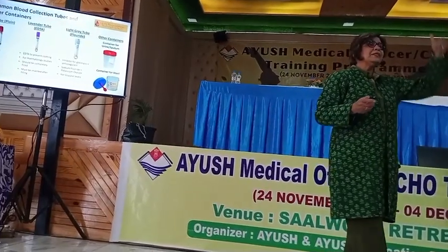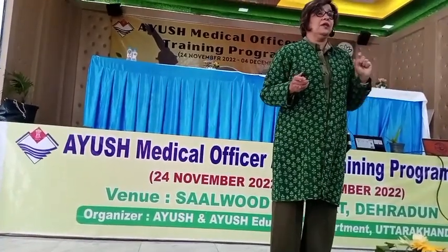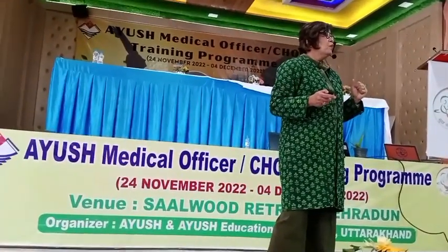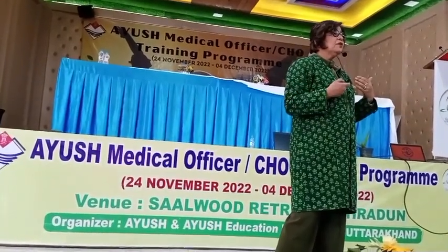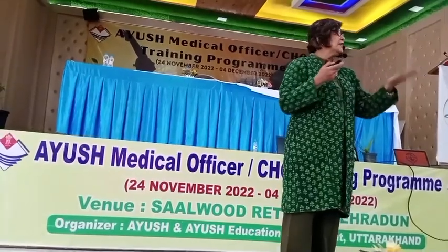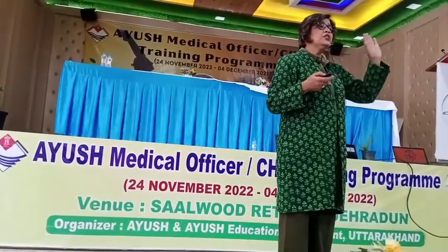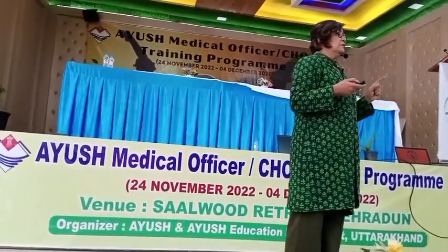Now what happens is sometimes the patient comes and says my hemoglobin is showing 6 grams, and it was never that low. Or a case comes where they say there are no platelets at all. Why? I'm a healthy patient. When I physically see the patient, I say his hemoglobin would be 11, but if the report comes as 6, where is the problem?